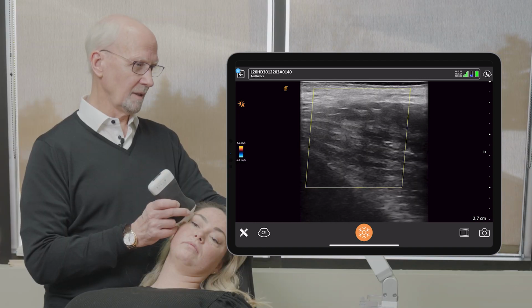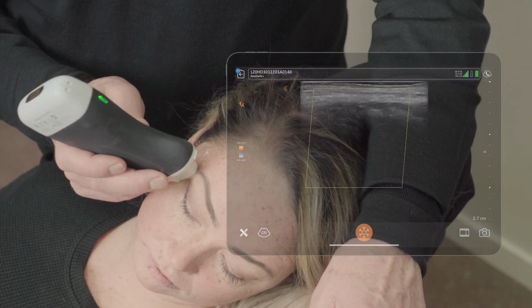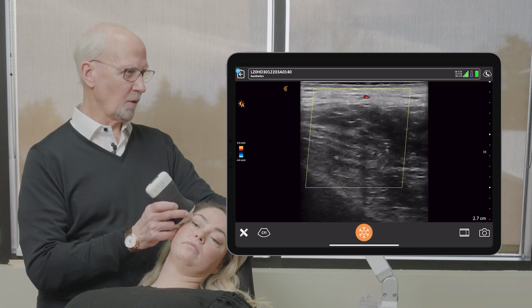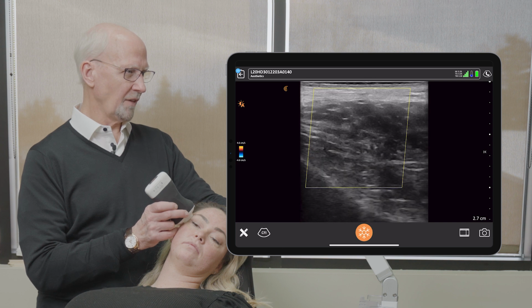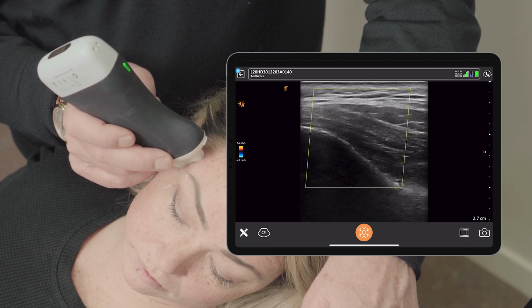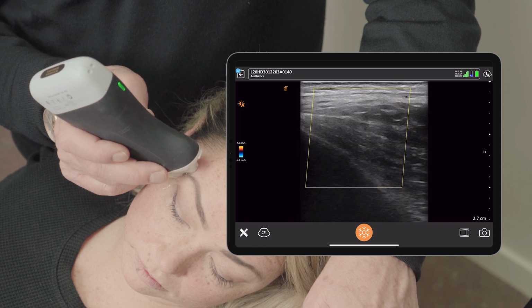Vascularity in the temple is extensive. You have a tremendous arcade of veins, particularly the sentinel vein here at the medial aspect. And you'll find it coursing throughout the temple. So there's lots of veins, and we'll just press on this and they'll go away. Now we also want to be looking for the superficial temporal artery because we'd like to avoid that while we're working.